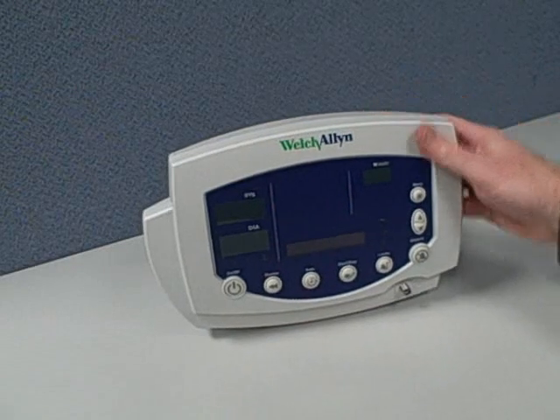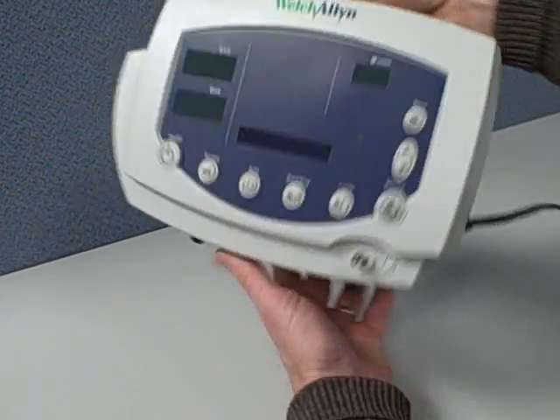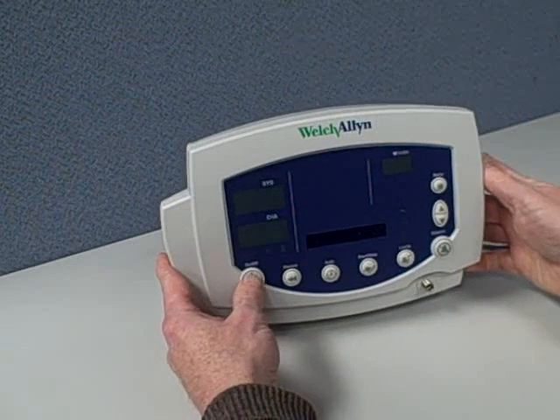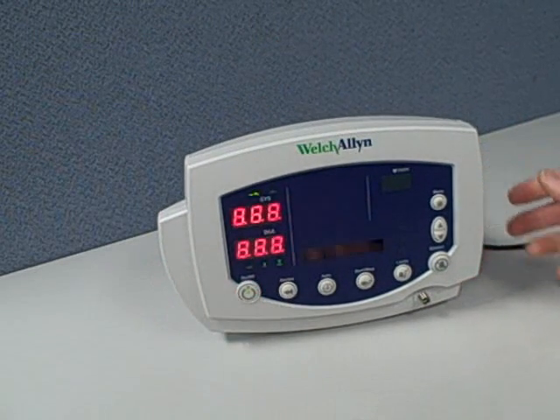Hi, this is Walt, and today we're looking at the Welch Allyn Vital Signs Monitor, 300 model. It's a nice lightweight machine, about four pounds, with a nice convenient handle.